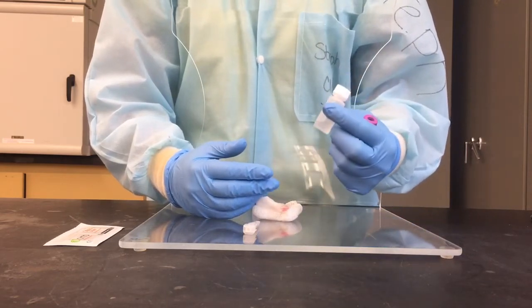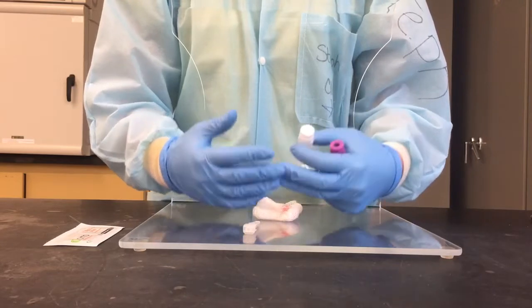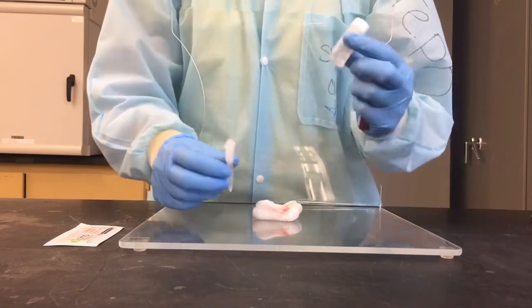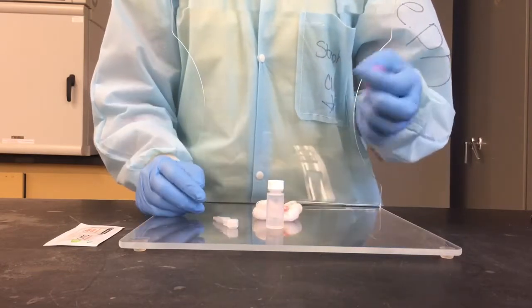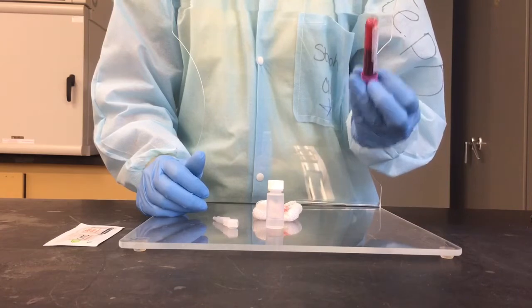So ammonium oxalate is going to help you lyse your red cells so that they do not become an interfering factor and make your white cell count inaccurate. In order to do the count, you're going to need a reservoir, and then you also need this pipette assembly. And you will need a tube of well-mixed EDTA blood. We will have that for you when you come into lab.